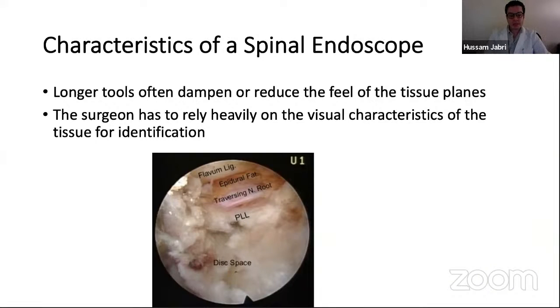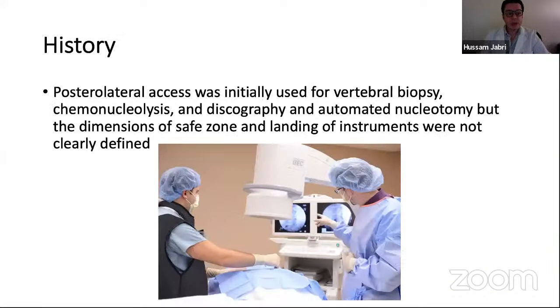This is only the working area, it is so limited. Historically, posterolateral access was initially used for vertebral biopsy, chemonucleolysis, and other discogenic back pain procedures.